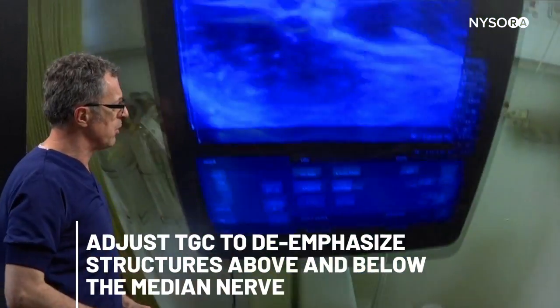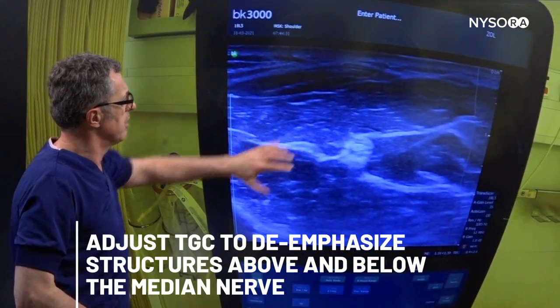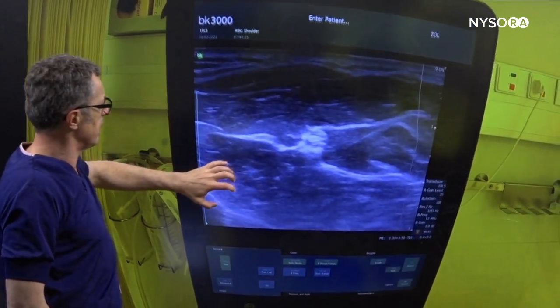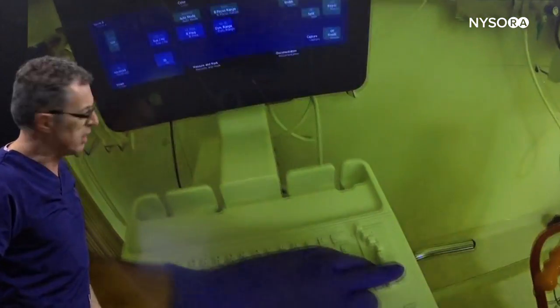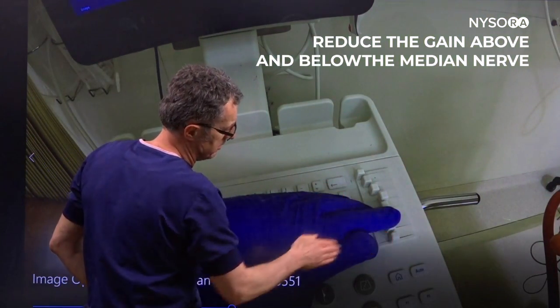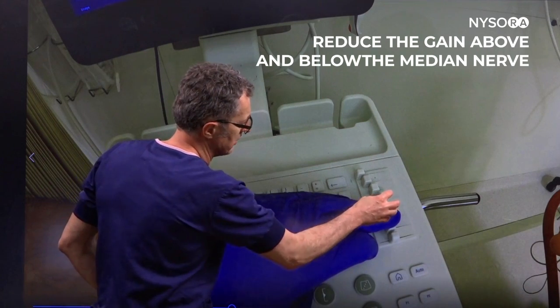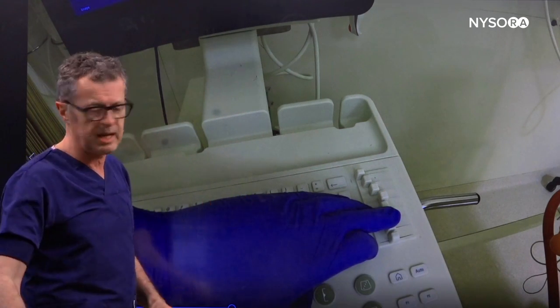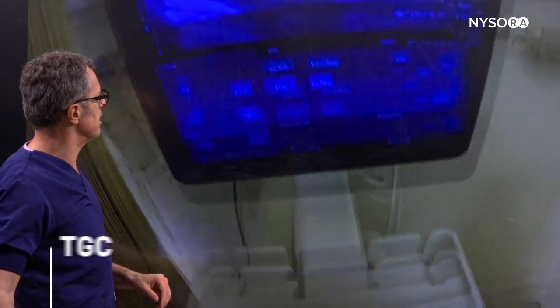The second adjustment is time gain compensation. We're going to turn down the gain in the upper part and turn down the gain in the lower part of the image. As you can see, the top has been turned down and the bottom has been turned down, while we left the center image untouched because we already adjusted the overall gain — and this is the resulting image.